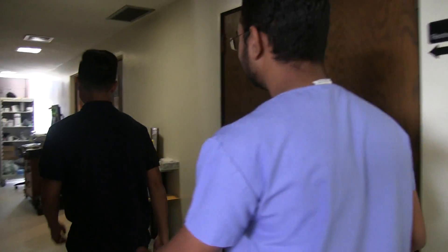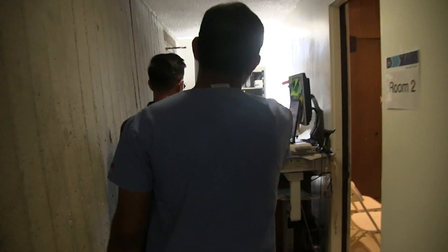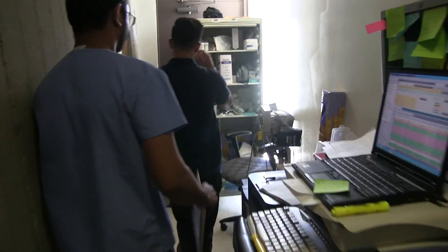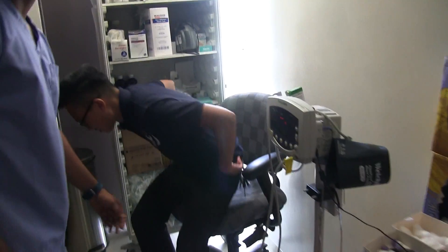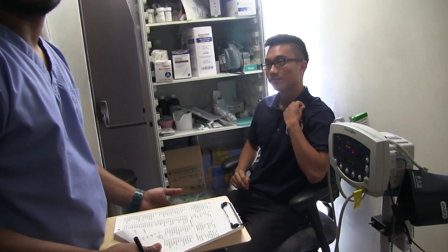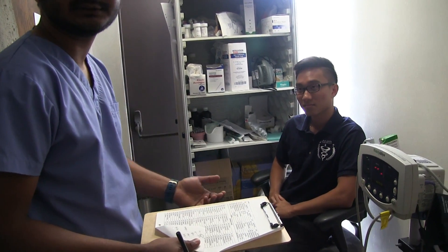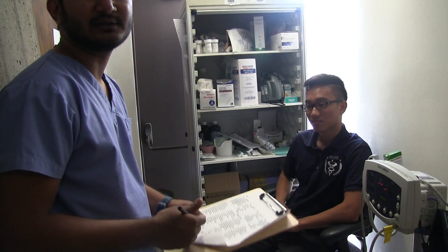Once we are done with taking the height and weight of the patient, we'll go to the back of the clinic to take the rest of the vitals. Right ahead on this chart — once we are here, I like to make sure to find out what the chief reason for visit is and note it down, so when I give the chart to the medical students, they know exactly what to treat the patient for.